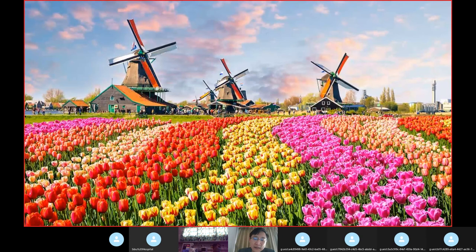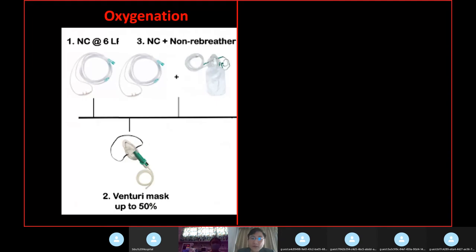The talk will be a mini online sharing of some basic, important information about the non-invasive ventilator, a little bit of history, and mainly focus on the technical part rather than the academic part that you can read day to day. First of all, we will talk about respiratory support, and a lot of times it is divided into two: whether you support the patient's respirations either with oxygen, which is oxygenation, or ventilation.